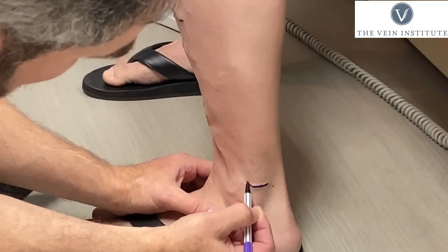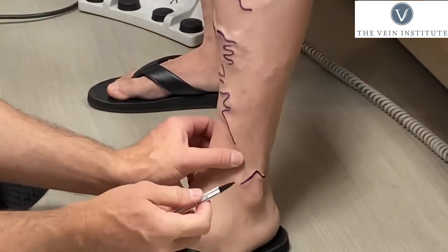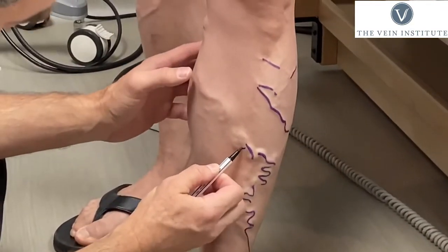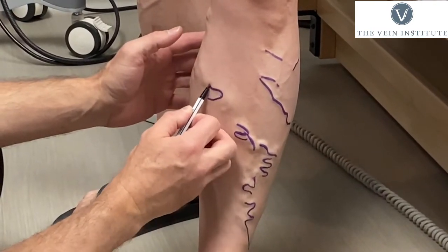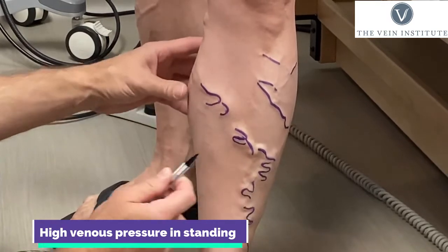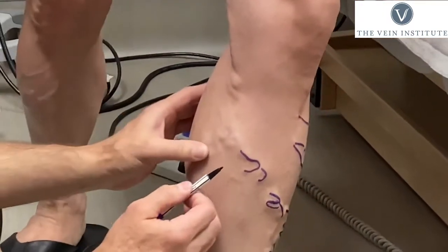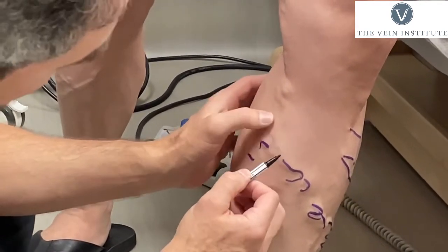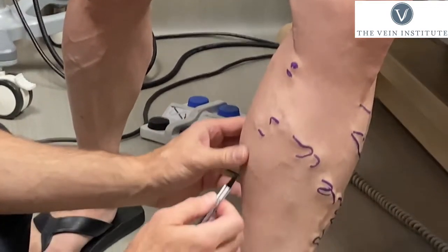This one comes all the way back — this is a very common one that typically runs across the Achilles here. This part doesn't have to be perfect because we're going to keep turning around. What we're going to do is actually use the vein light to show us more that we can't see here.